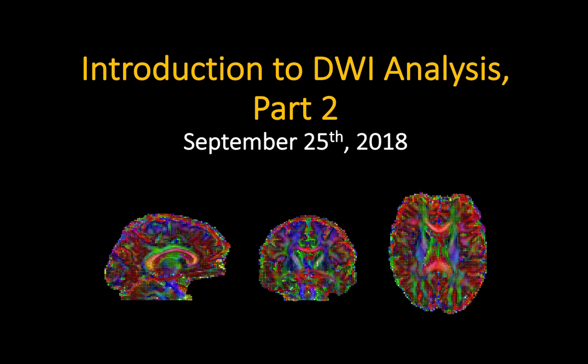And one thing that we can usually do is called diffusion tensor imaging, which is fitting tensors in each of these voxels of the brain. And once we do that, we can have some sense of what the orientation is of the fibers and how strong that directionality is.